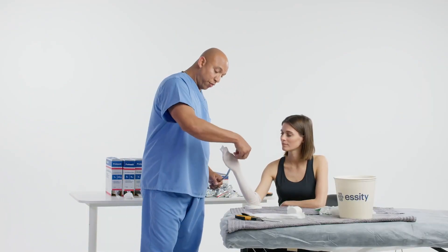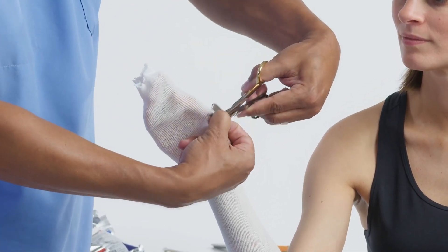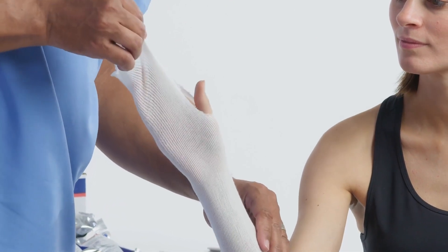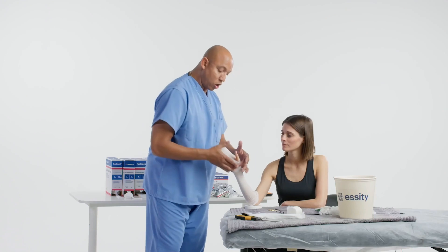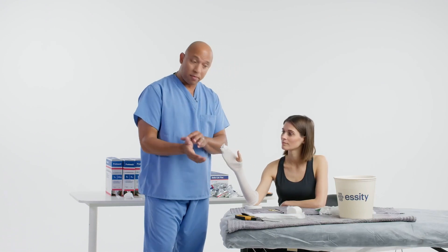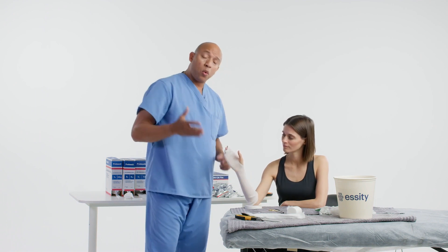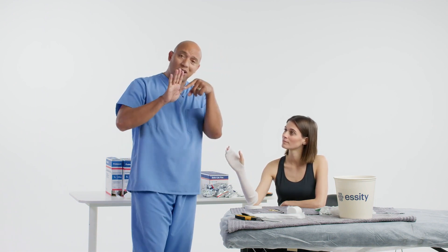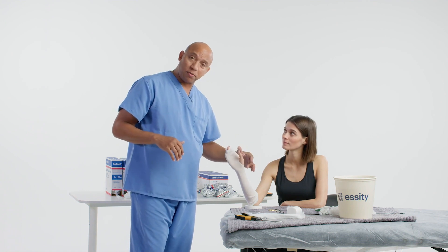Now we're going to make a little hole for the thumb. We'll slide that over so we can see what we're doing, and then make a hole big enough for the thumb to go through, but not too large where it opens up too much of the thenar eminence. As you put this short arm cast on, we're going to concentrate on making sure it's angled down and also leaves enough space for the range of motion of the thumb.